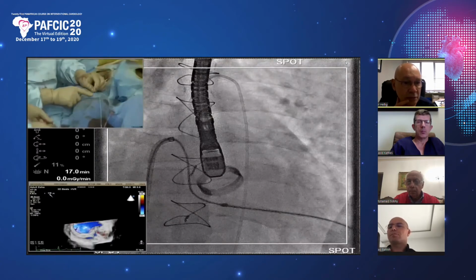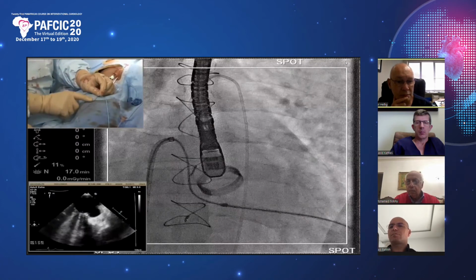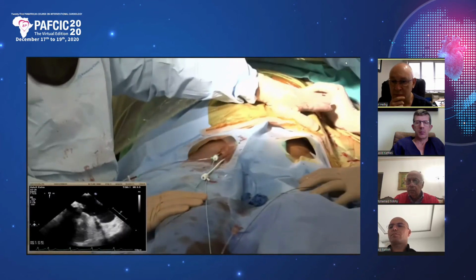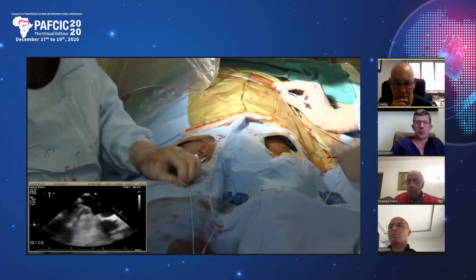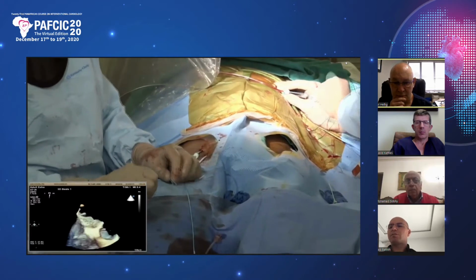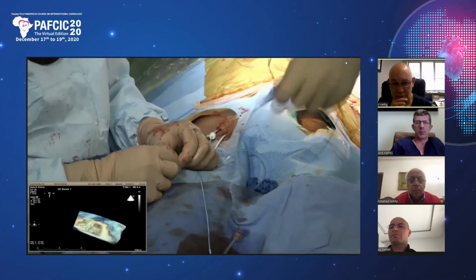So you've got the catheter out of the transeptal sheath. So now we've got a catheter outside the body on both sides through the patient. So I'll just ask Shaheen to pull the wire right out. And then I want to implant a super stiff wire, please. So I'm going to give the super stiff from this end to Shaheen.